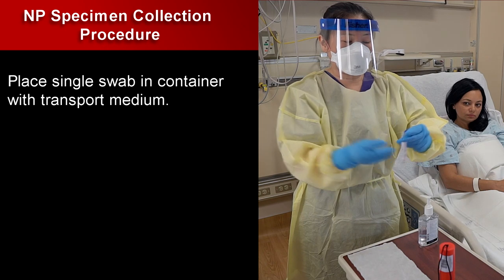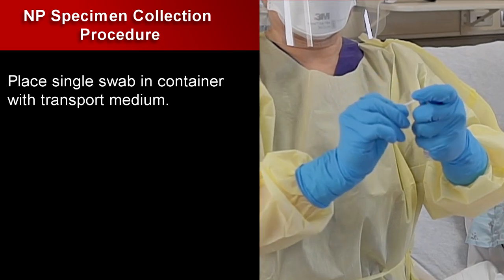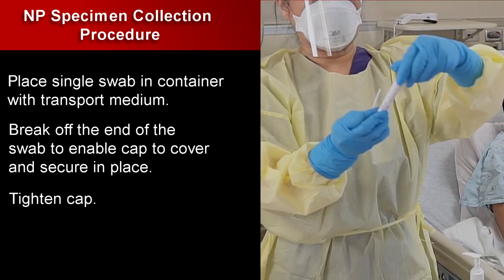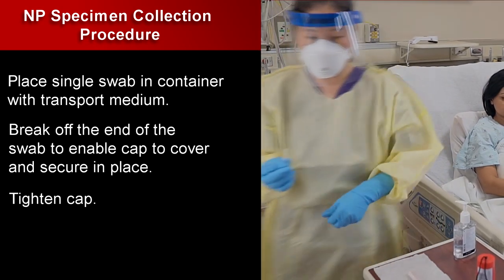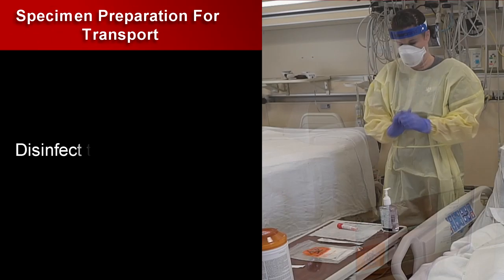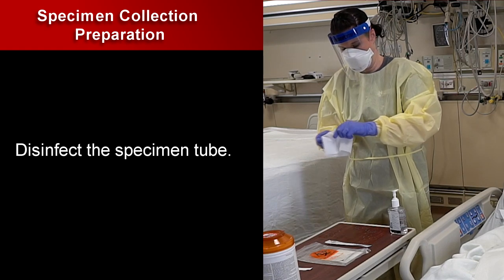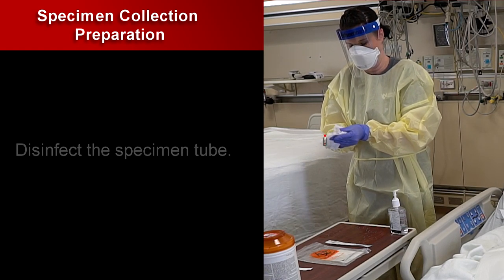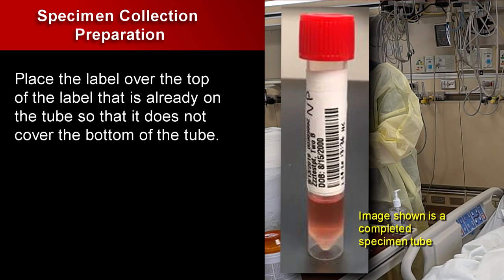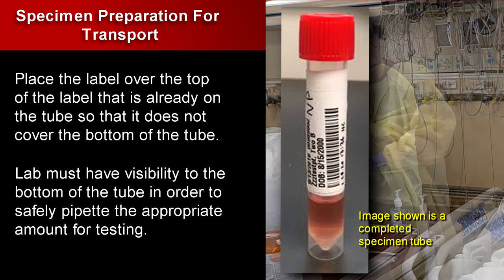Place the single swab in the container with transport medium. Break off the end of the swab to enable the cap to cover and secure in place, then tighten the cap. Dispose of the broken tip into the sharps container. Disinfect the specimen tube with the disinfectant wipe that is laid out on the table. Place the label over the top of the existing label on the tube so that it does not cover the bottom of the tube, as the lab must have visibility to the bottom of the tube in order to safely pipette the appropriate amount for testing.